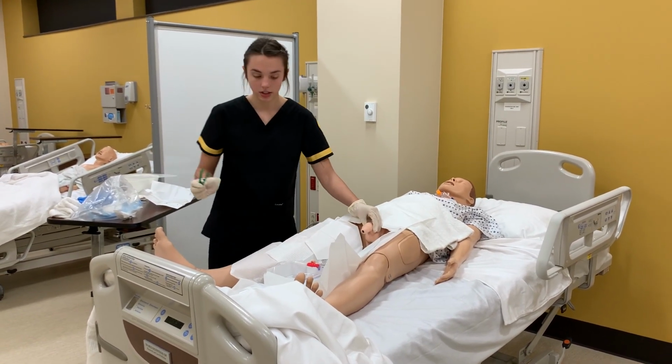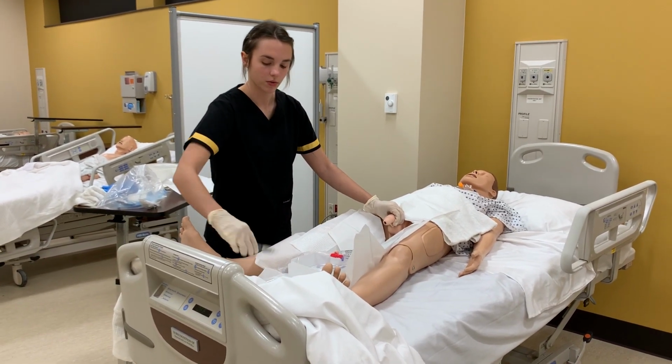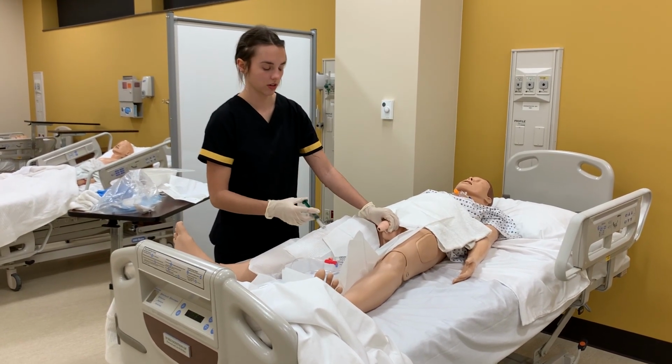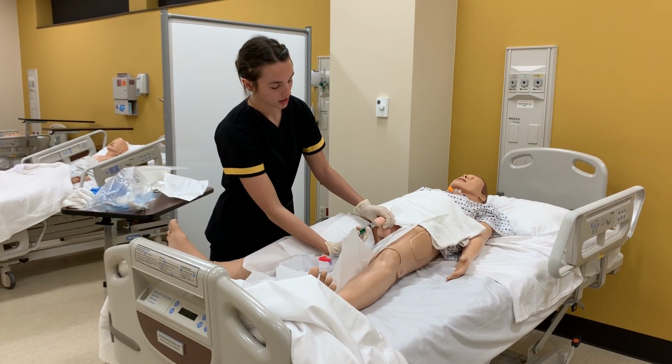So now we are all sterile and good, and before we begin, we insert the lubricant into the penis. We don't put it on the outside of the catheter, so we would insert just a little.